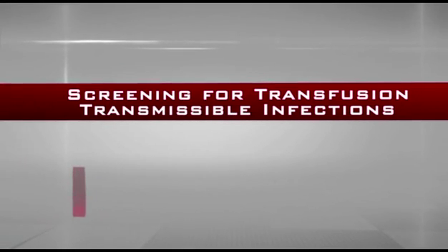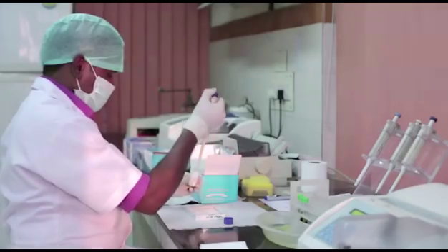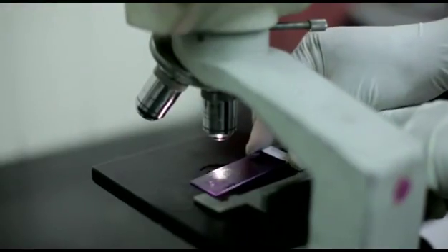Screening for transfusion transmissible infections. Screening for transfusion transmissible infections is critical in blood transfusion services to ensure patient safety.